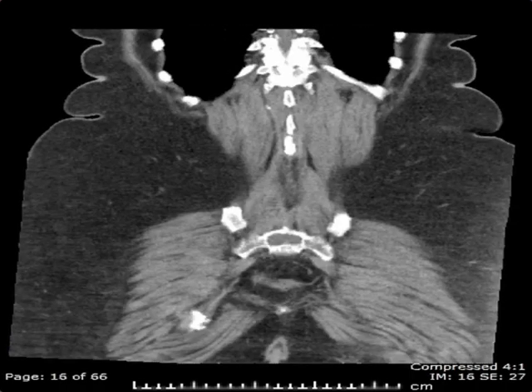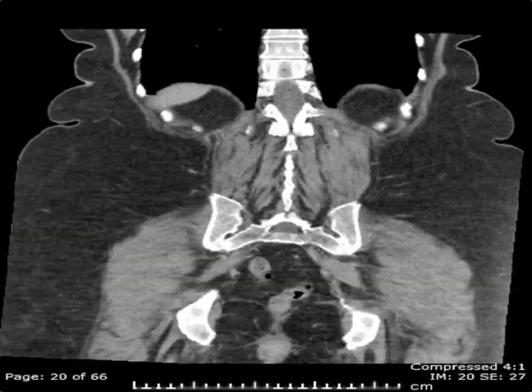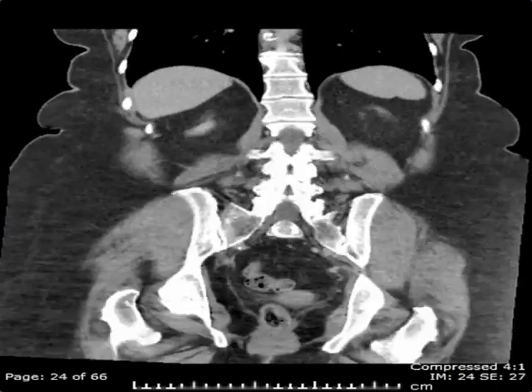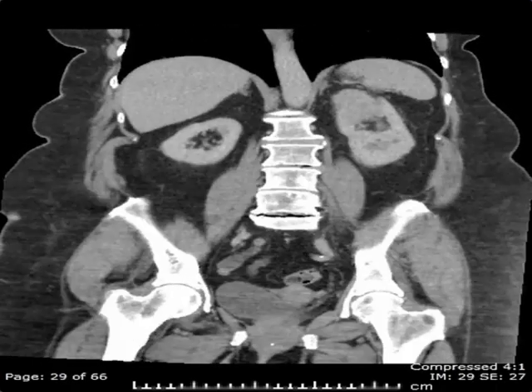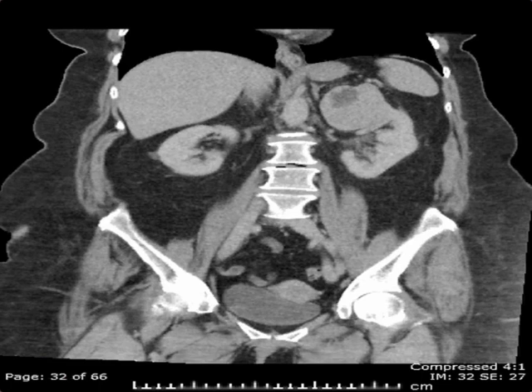As we go from posterior to anterior, the posteriormost structures we'll see first are the spine, some of the ribs, and other bony structures, and then we'll start to see the kidneys.